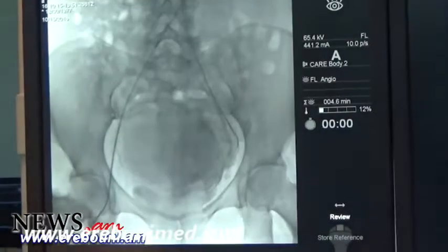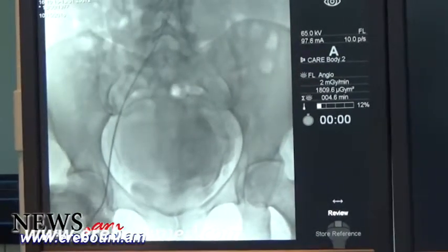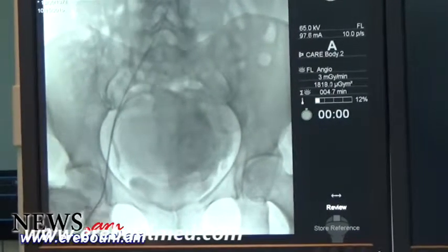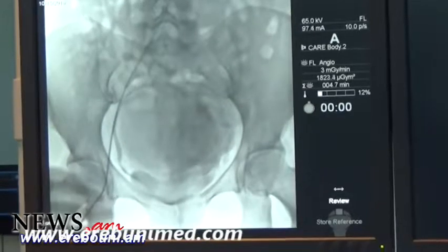Look how it has decreased. We should wait a little, as it will take several minutes to evaluate a stable final result.